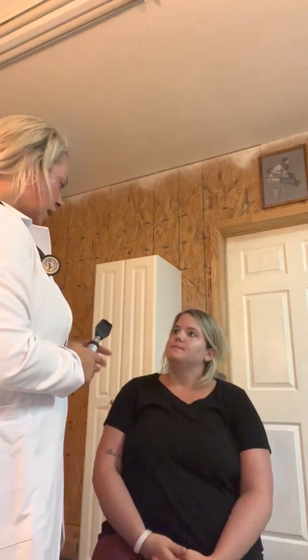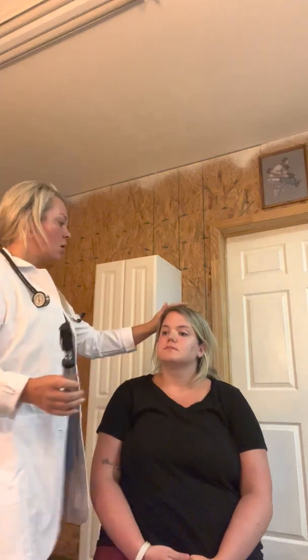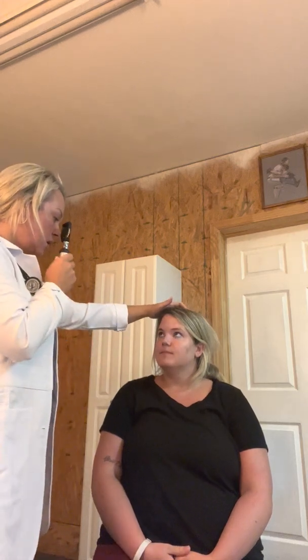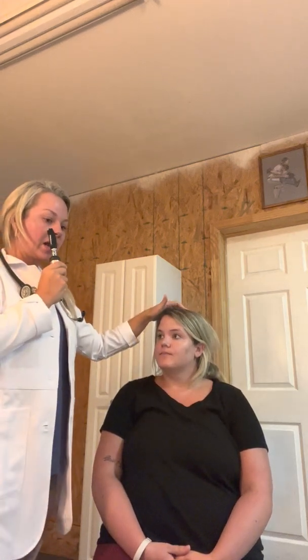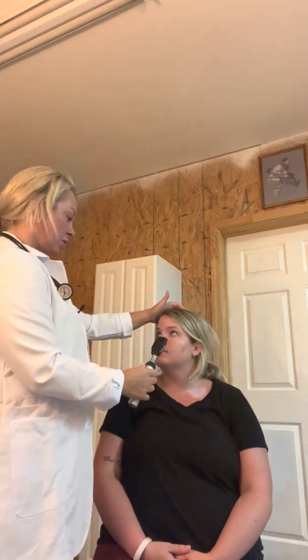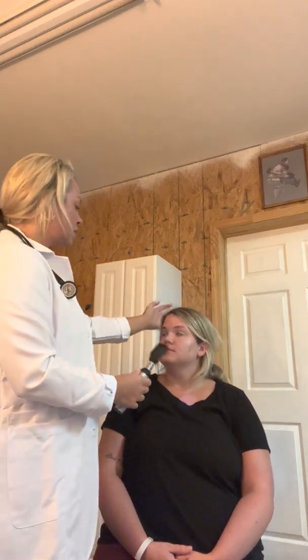Now I'm going to use my ophthalmoscope, and I am going to examine more of your internal eye. I'm going to hold your head at about a 15-degree angle. I'm going to come in with my ophthalmoscope and examine your eye. I'm going to use my right eye to examine your right eye, and then I will use my left eye to examine your left eye when we go to the other side. We're going to start with the right eye. I'm going to have you look straight ahead.